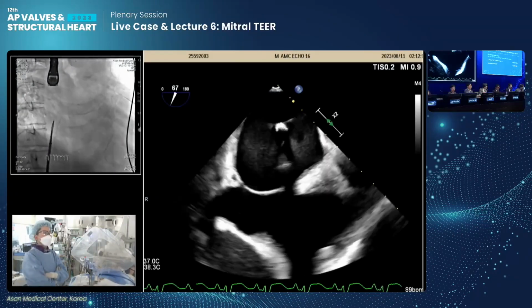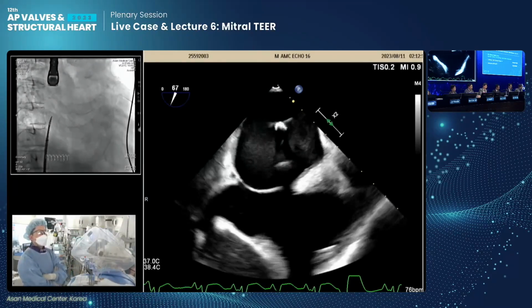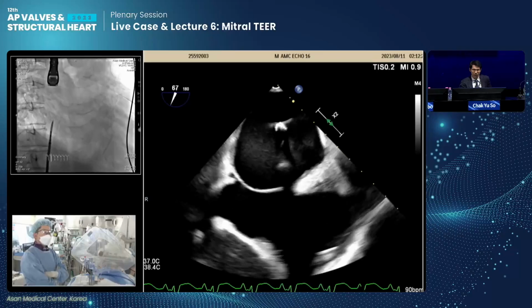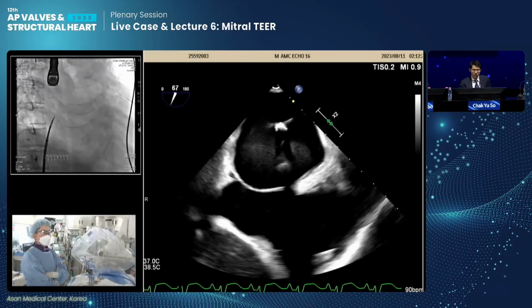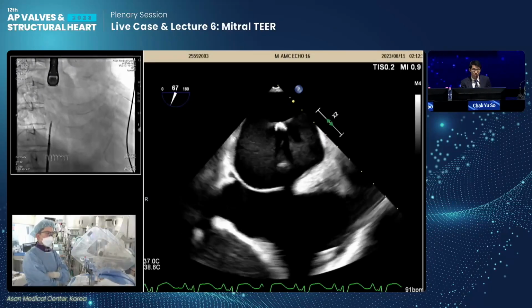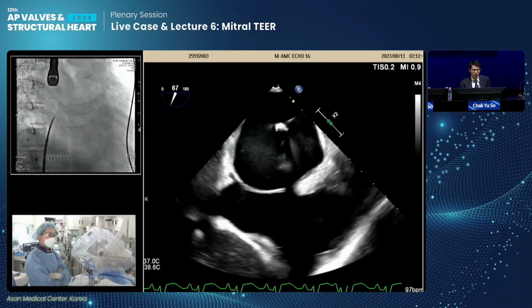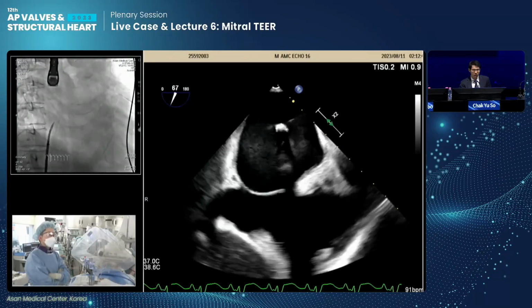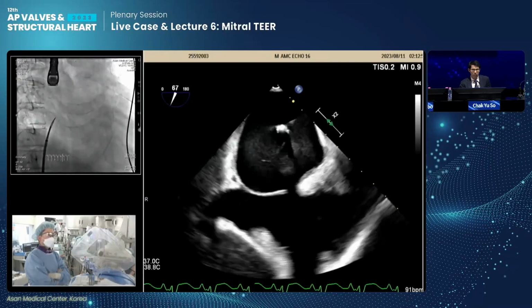Dr. Kang, this is Kent from Hong Kong. So my first question that I want to discuss is, would you have done the mitral clip even earlier? Because from time to time, we actually see patients that have severe mitral regurgitation after a myocardial infarction that cannot be stabilized. And as you mentioned, your patient was put on ECMO for quite 2 months already. I mean, has been lingering in hospital for 2 months. What is your standpoint of performing the edge-to-edge repair as a sort of salvage operation at the get-go, rather than like what you do now, wait to titrate the medical therapy?